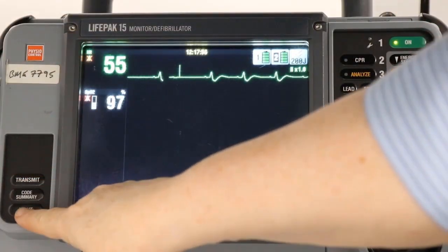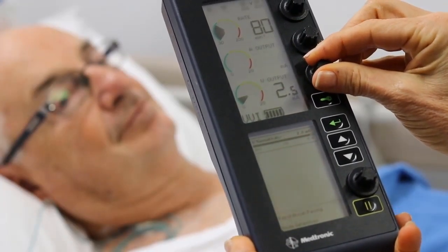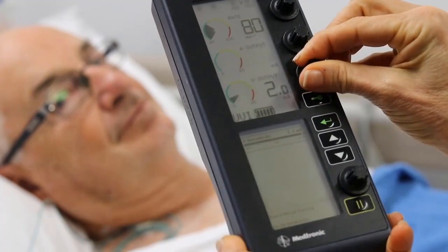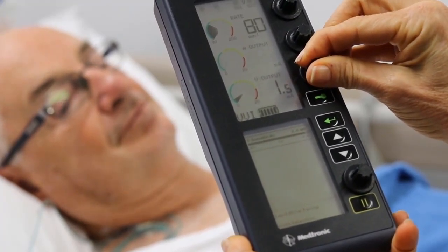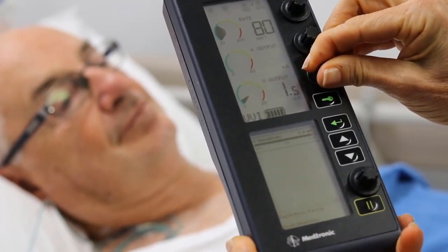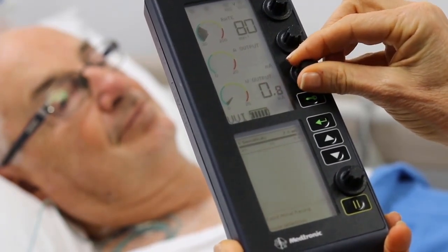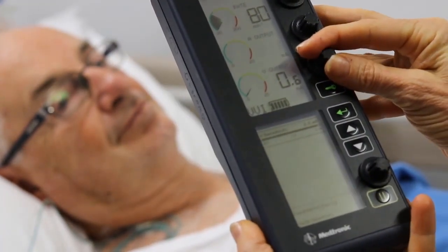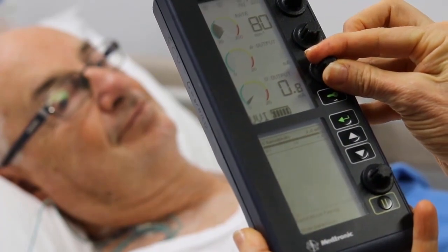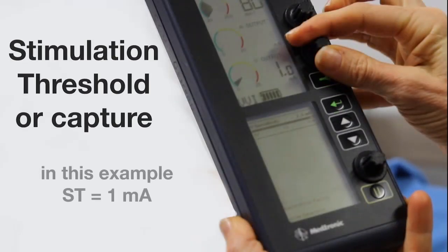Obtain a rhythm strip. Decrease the output setting until loss of capture occurs and note the numeric value. Increase the output setting until you just see that capturing is occurring. This is called the stimulation threshold or capture.